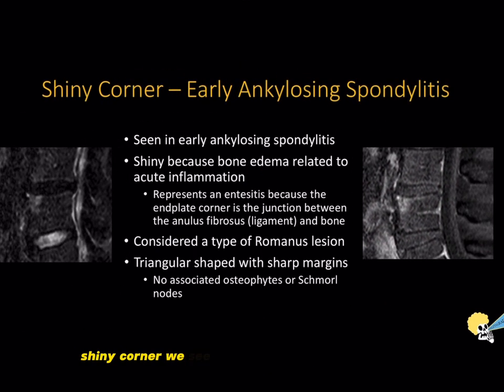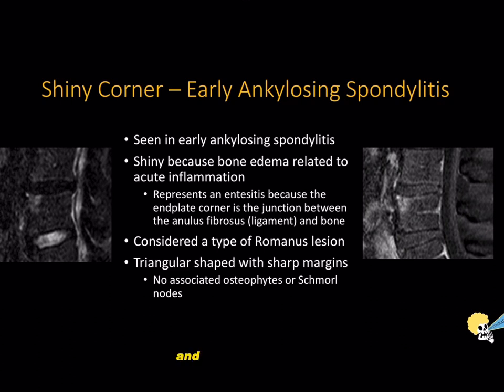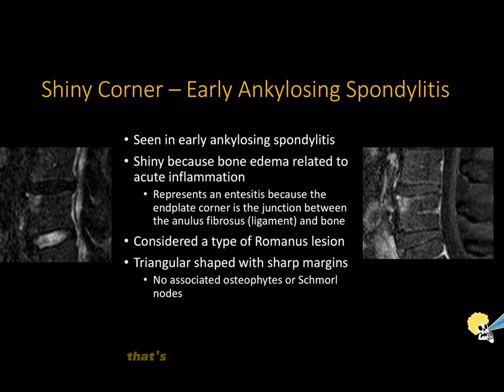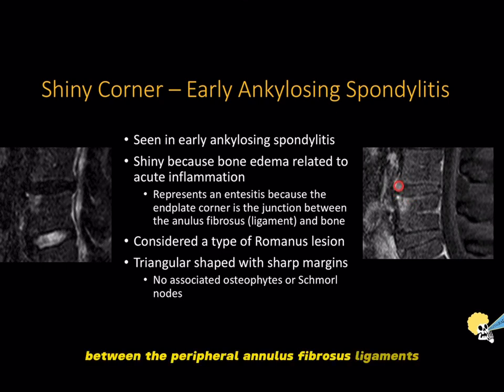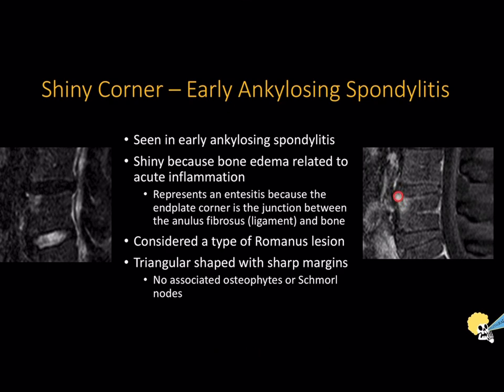The shiny corner sign is seen with early ankylosing spondylitis, and this corner is shiny because there is bone marrow edema related to acute inflammation — that's why we also have enhancement. The region of the shiny corner is an enthesis, because it is the junction between the peripheral annulus fibrosus ligaments and the bone of the vertebral body, so it is considered an enthesitis.